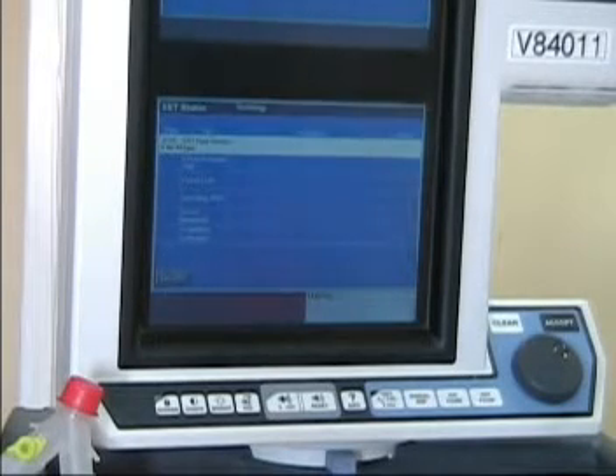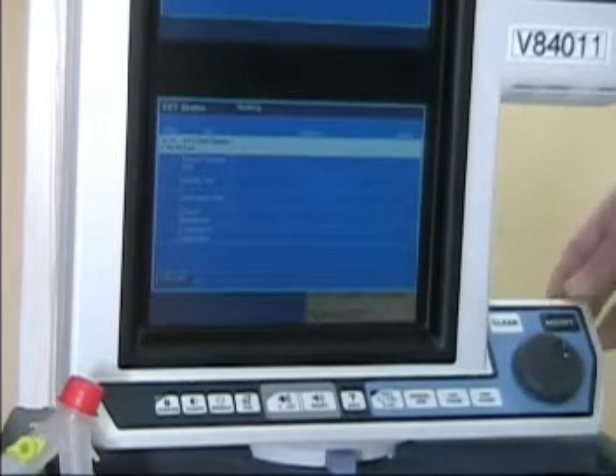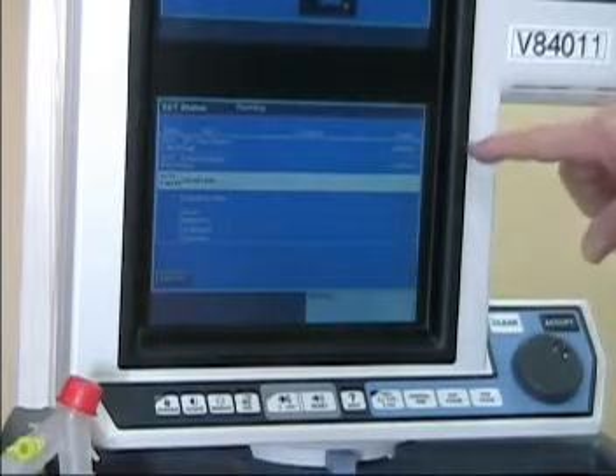This will take about five minutes to test the system. It says now connect humidifier if acceptable. We passed the flow sensor, and now it's going to pressure test the circuit — that has passed.